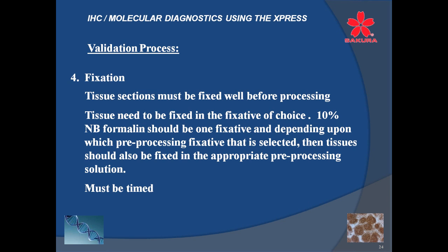You can mount these on the same slide so you could see the variability of staining there if there is, and in most cases there will be, depending on the fixative. But it gives you a nice tool to see what may be very good for that particular antibody. But again, it's going to require a lot of time and a lot of validation to do so. The reason I do try these things and like to get involved with them is because of where I think we're going with molecular studies in not too awful distant future. And I'm going to save more of that conversation for the last slide.